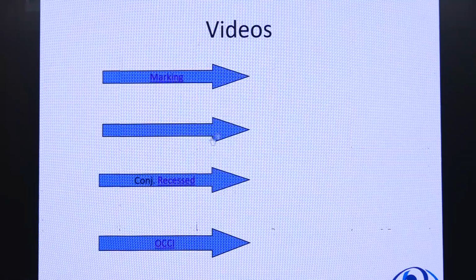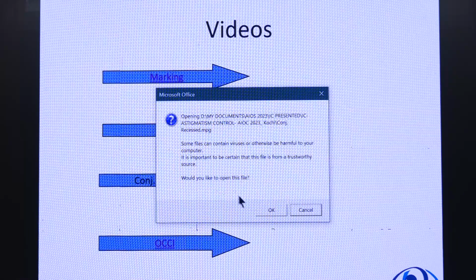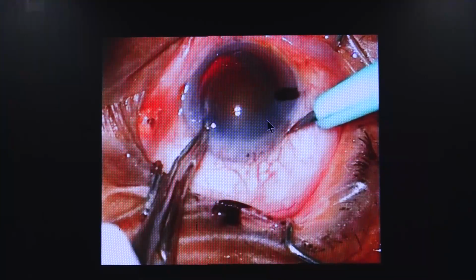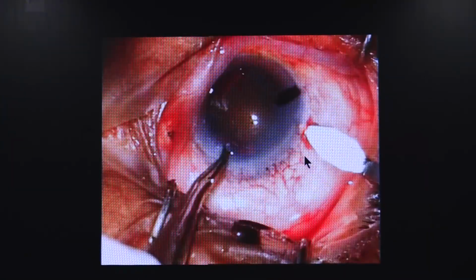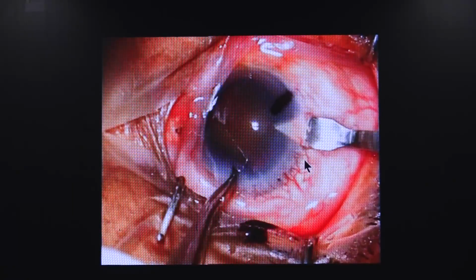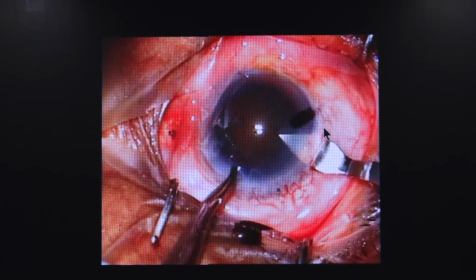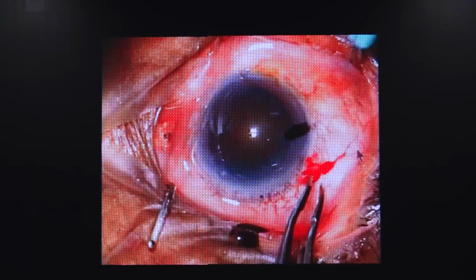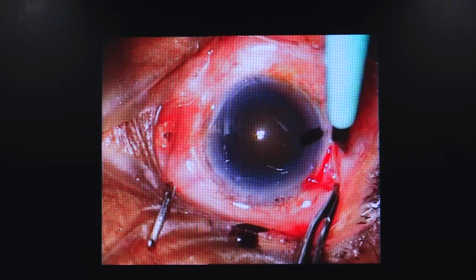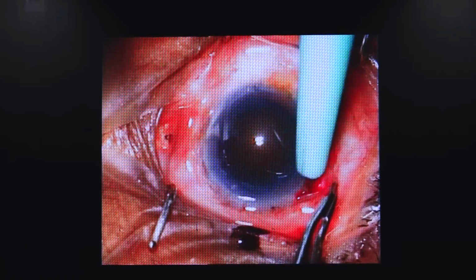Then the tip that I gave you about ballooning of the conjunctiva, if you're going a little posterior limbal or scleral, you see I've got posterior almost, it's a little between posterior limbal and scleral. So I've made the incision, and now if I continue with phaco, this conjunctiva will balloon up. So that's the tip I gave. Just do a little peritomy around that. This area is clear and you'll be comfortable during the surgery.